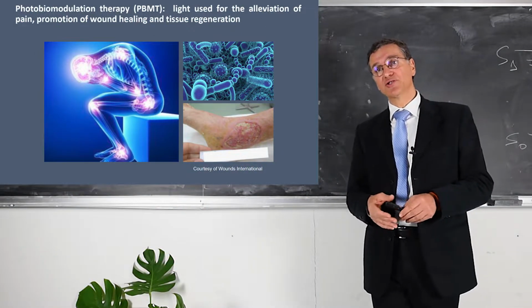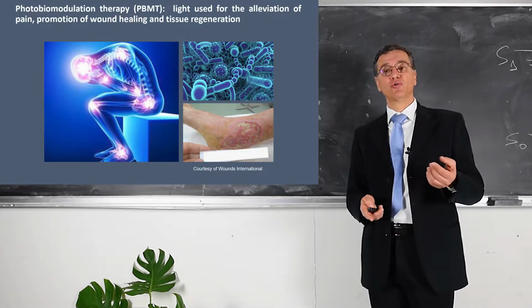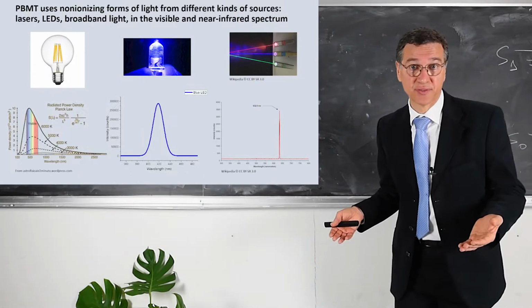Photobiomodulation therapy is commonly used to alleviate pain, to promote wound healing and tissue regeneration. And to do that, we can use different kinds of light sources.